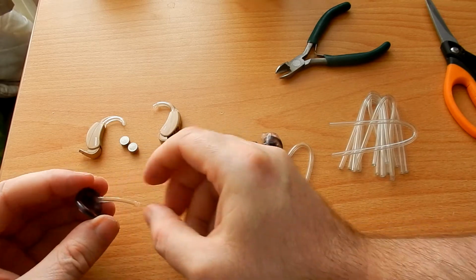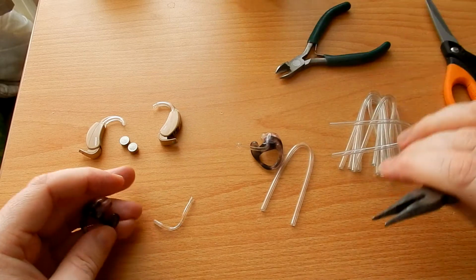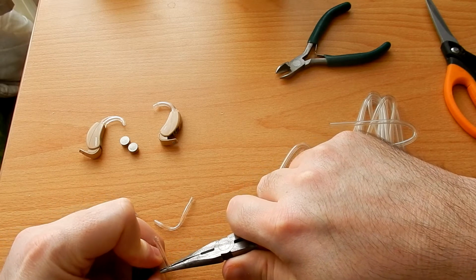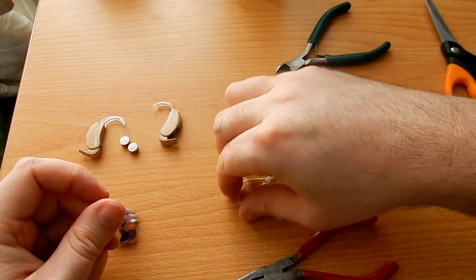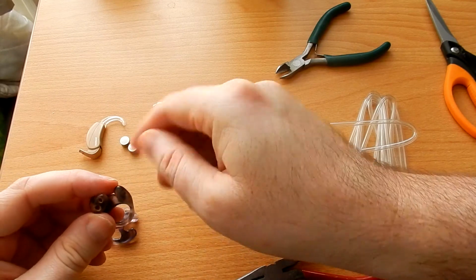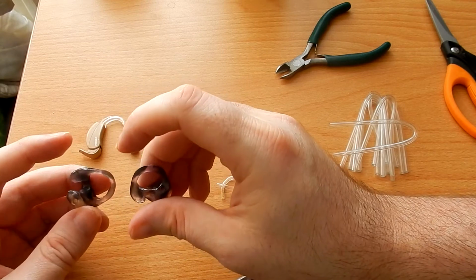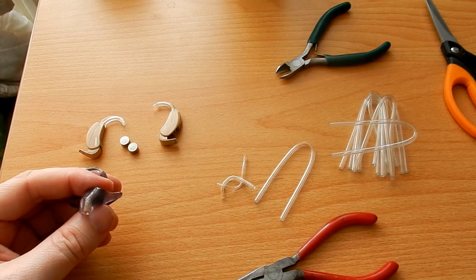Next we have to remove the tubes. They just pull straight out, like so. As you can see, they are absolutely disgusting. So what I will need to do now is pause, because I will need to go and give these moulds a bit of a wash as they are actually filthy as well. So I'll be back.